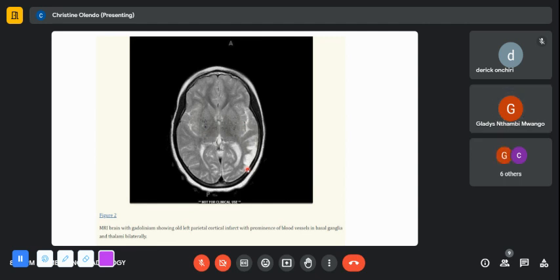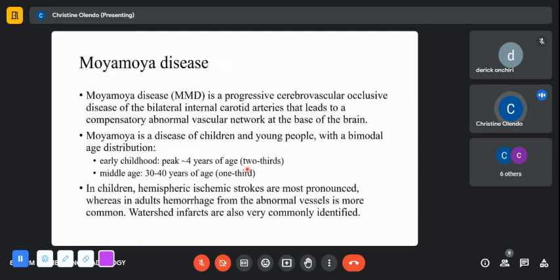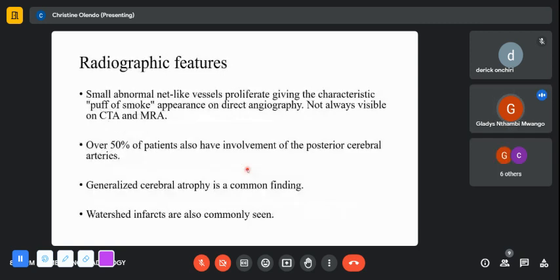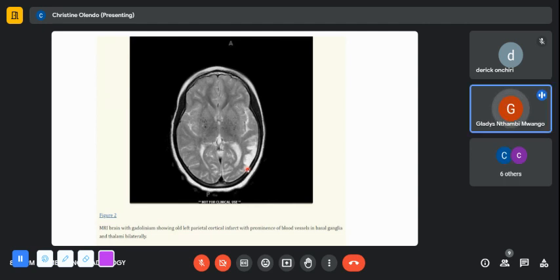Yeah, there was vasocclusion. There was a stenotic area. I think I did it in summary. Of the internal carotid, yes. Of the internal carotid, sometimes the cerebral arteries. So you have dilatation of the perforators, so you can get an alternative pathway of blood supply.